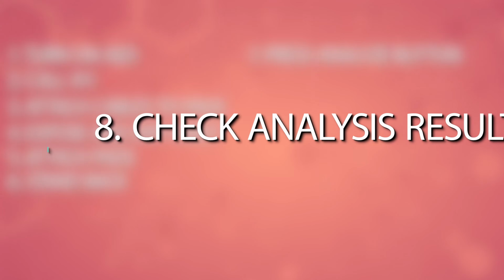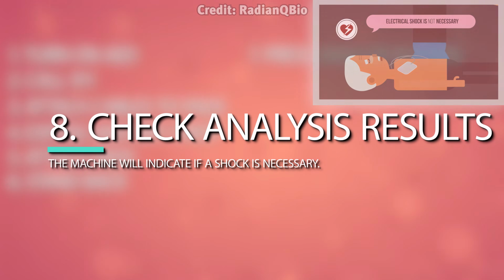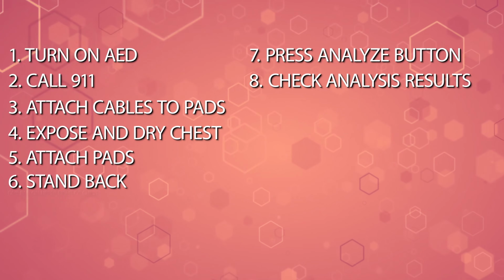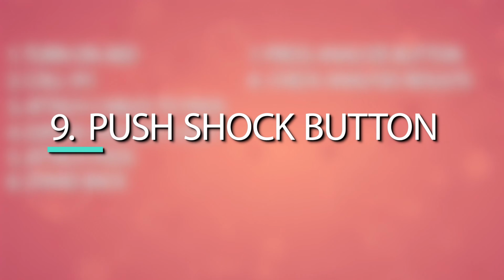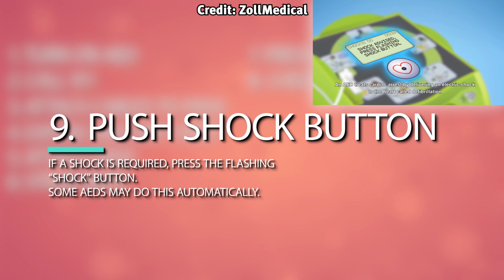Step number 8. Once the machine has completed its analysis, it will clearly indicate whether a shock is or is not required. Step number 9. If a shock is required, push the flashing shock button. Keep in mind, some AEDs will automatically apply the shock if it is required.